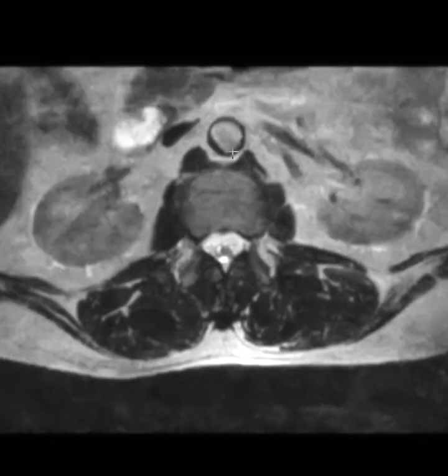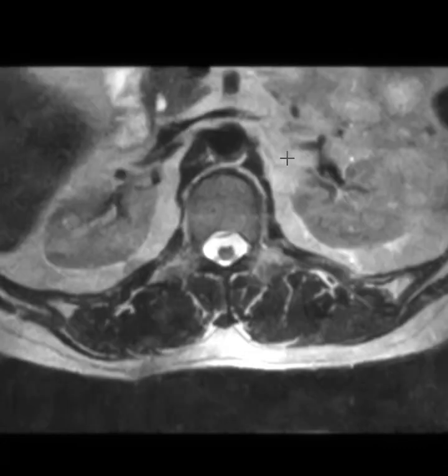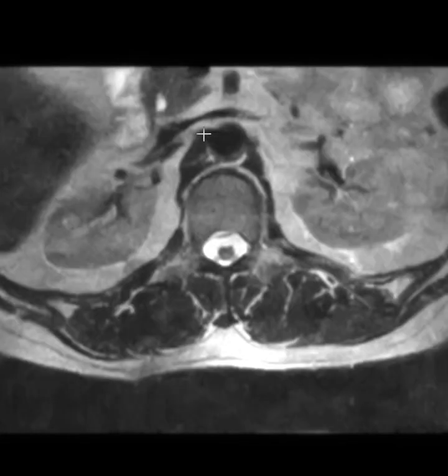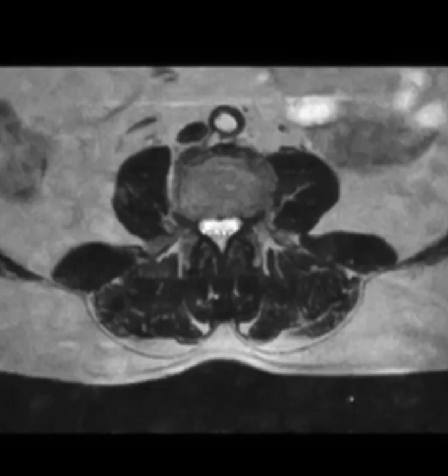We can see the same thing here. There should be dark. This is the inferior vena cava that has flowing blood, which is black, and this should be the same darkness, but instead you can see wall thickening, some atherosclerotic disease. Above the thrombus we see the normal flow void, which is dark. You can see the renal arteries flowing blood dark. So this is an infrarenal thrombus. Cast-like thrombus fills the aorta and goes down into the iliac arteries.